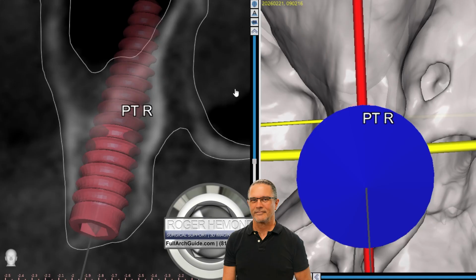I've got several clinical videos, surgical videos of the pterygoid guide being used and implants being placed, achieving stability in the 80s. Not every case achieves that, but we certainly most always achieve above minimum loadable torque with this protocol.